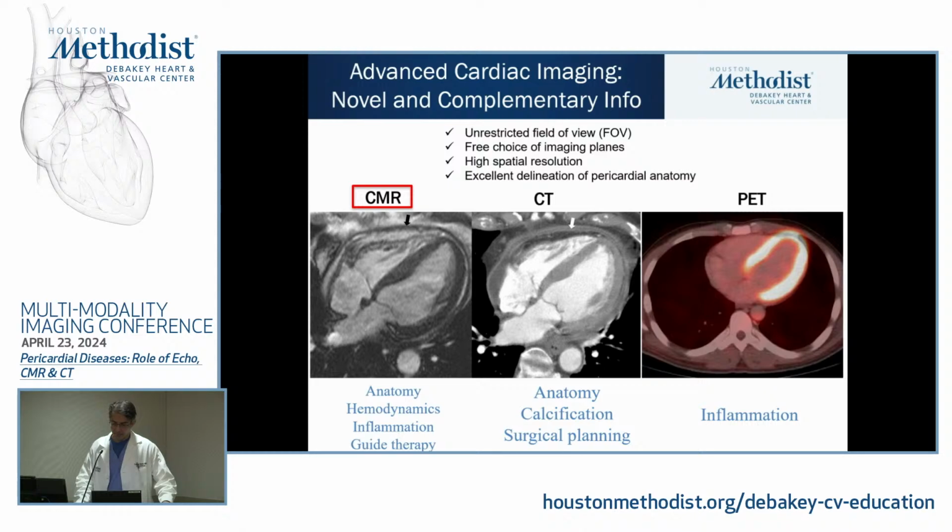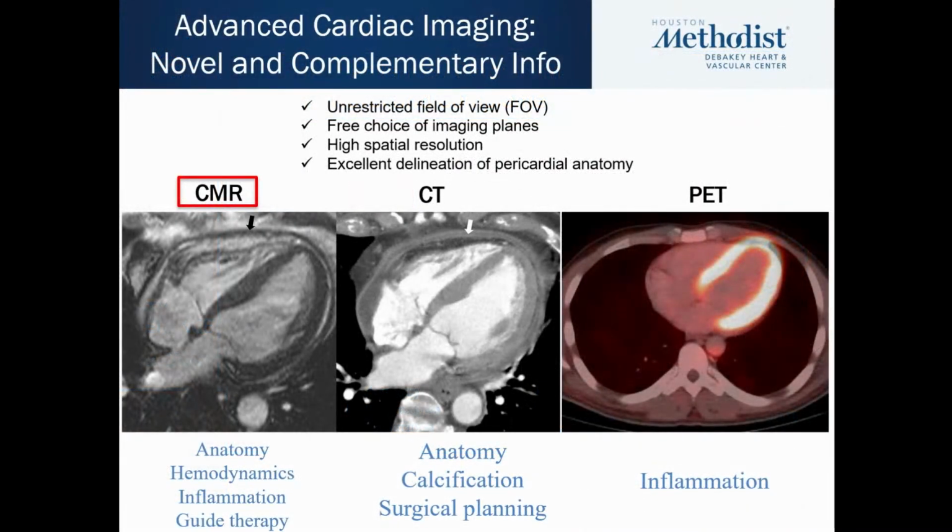So that's where my role comes in, to educate you all how some of these advanced imaging techniques, including cardiac MRI, cardiac CT, and believe it or not, I have a couple of slides of PET, can be very helpful and complementary to echocardiography. And all of them, other than PET, have large fields of view, very high spatial and temporal resolution, and a great ability to actually see the structure that we're talking about today, which is the pericardium.